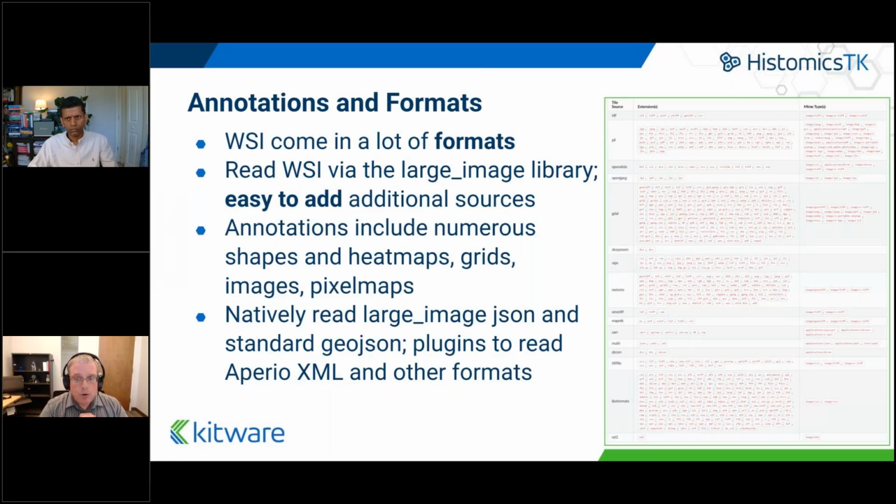And the goal is to be able to read these as they stand. We have tested this with a huge number of different formats, but there's always more formats. Someone's going to come up with a variation we haven't seen before, and we can just work with that. It doesn't take a lot of effort to add support for additional sources. And similarly, on my right, I have a list from some of the documentation of all the different file extensions that we have tested and said, yes, it can read that file extension.